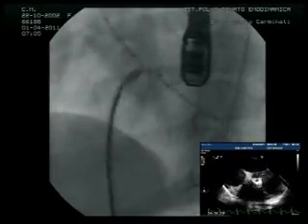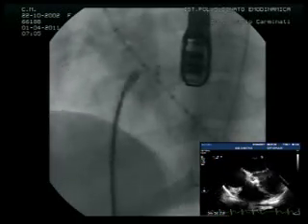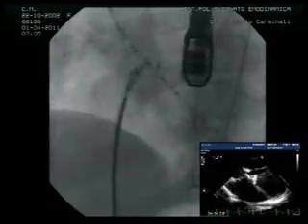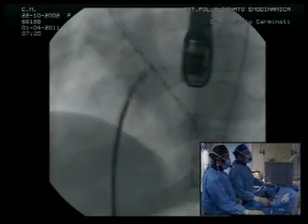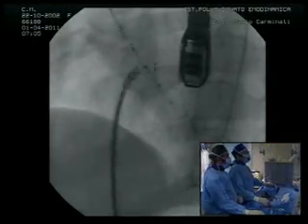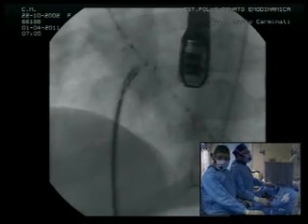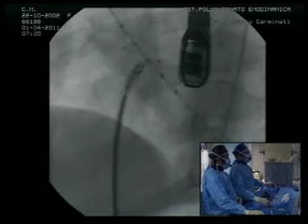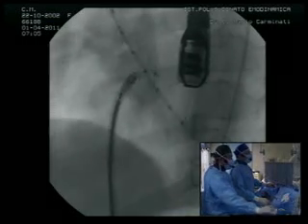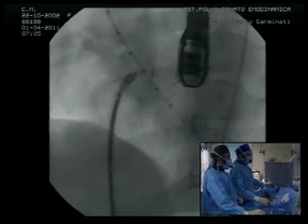While you're doing this pullback with the left side already open, do you check for MR? Do you check for mitral regurg? Well, we can do that easily. It's a long way away, as you can see there. There is no mitral regurg. So the question at this point is how much we're in the defect and whether we're in a position to start doing the right disc.